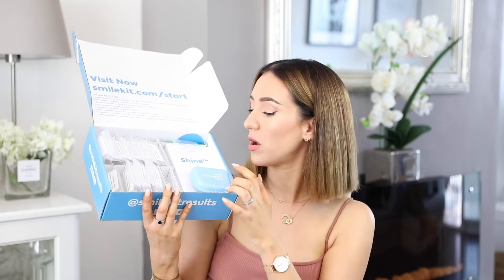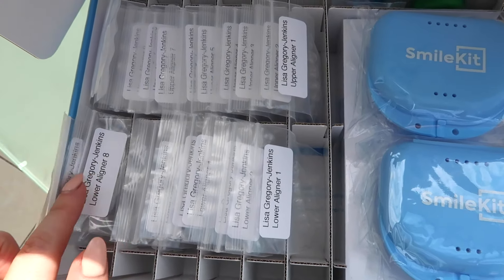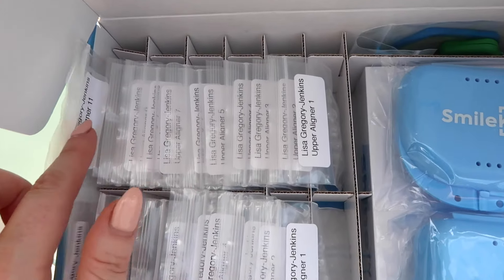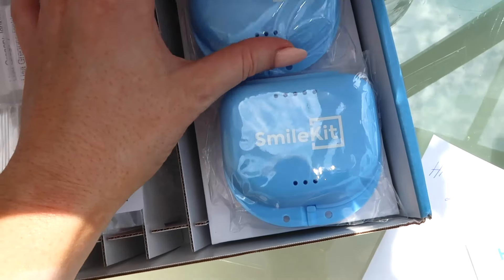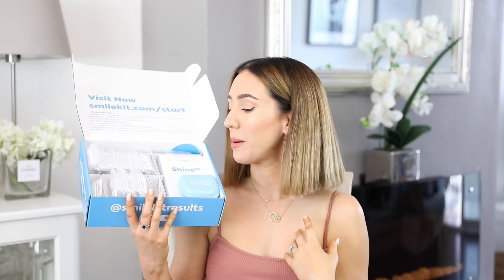The exciting part is inside the box. There were two cases - one is in my bag and this one is staying in the house so that if I'm out and about and eating, I can pop them in there and then go to the bathroom to clean them before putting them back in. They are a nice color too - my favorite color.